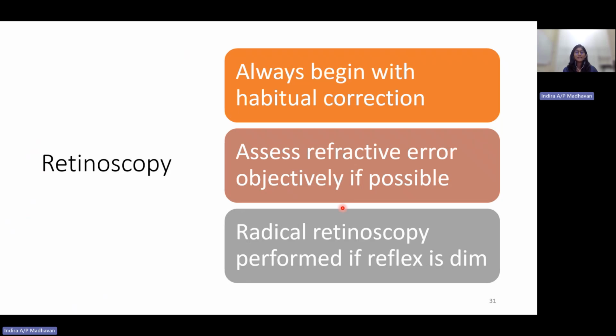So assessing refractive error objectively would make things easier when it comes to subjective refraction later.